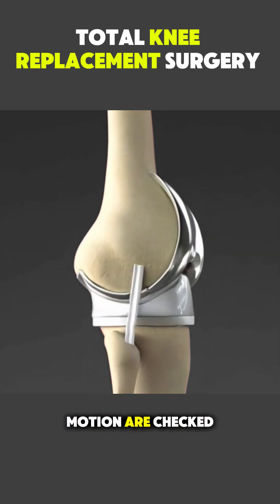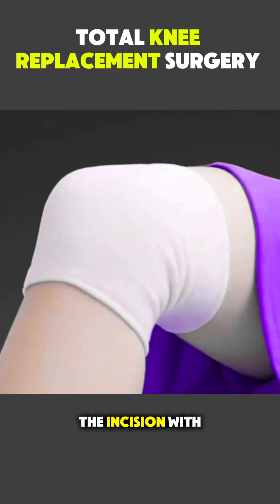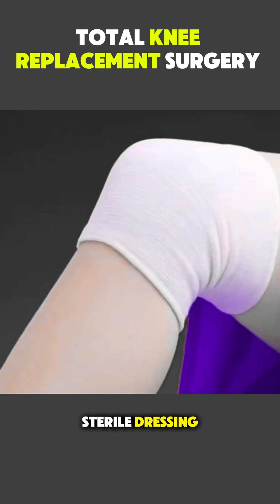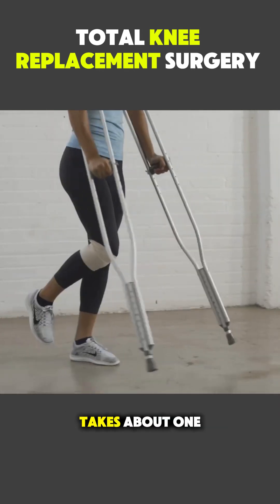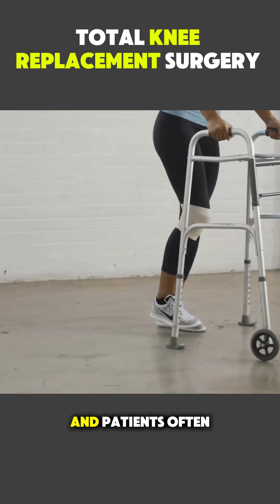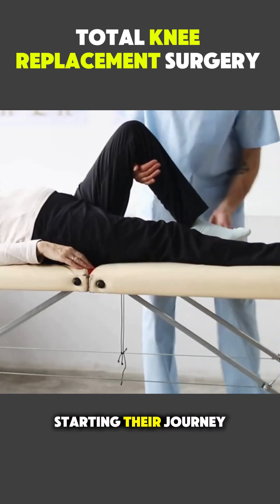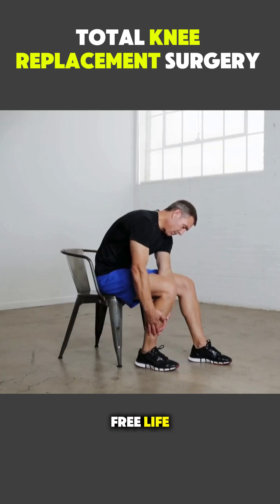Once alignment and motion are checked, the surgeon closes the incision with sutures or staples and applies a sterile dressing. The surgery typically takes about one to two hours, and patients often begin gentle movement the same day, starting their journey toward better mobility and a pain-free life.